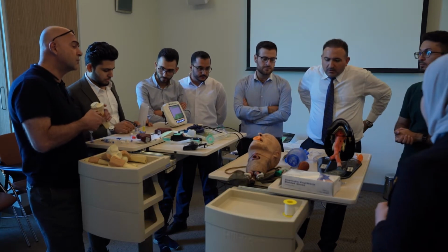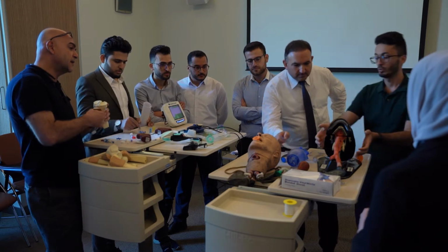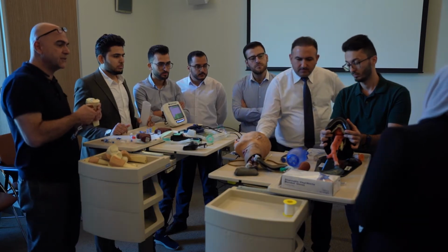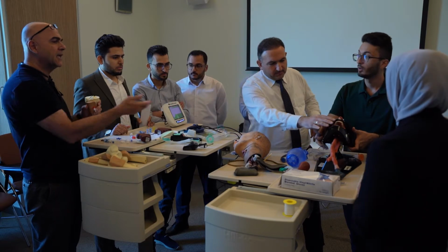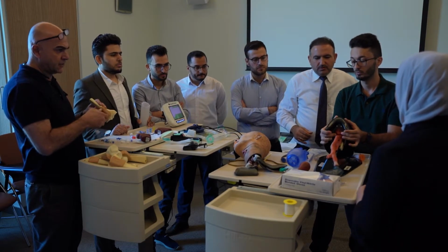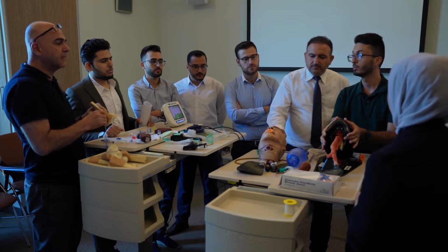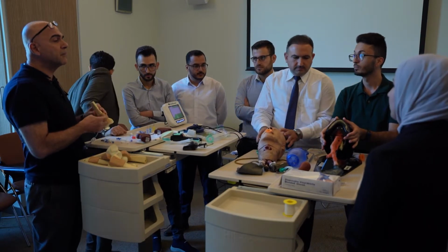Okay, how are you going to do suction? Just show me. Do head tilt and chin lift, and use the suction and tell me. Good. This is jaw thrust and head tilt and chin lift. First adjust it a little. Neutral position. Yes. Now do head tilt and chin lift for me. This is jaw thrust. Okay. Head tilt, just tilting the head and lifting the chin. Okay. Now, how are you going to keep this maneuver?